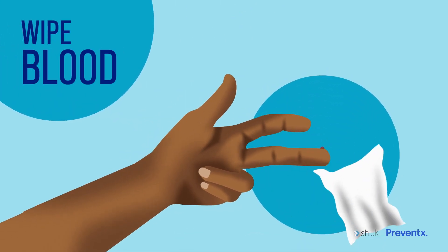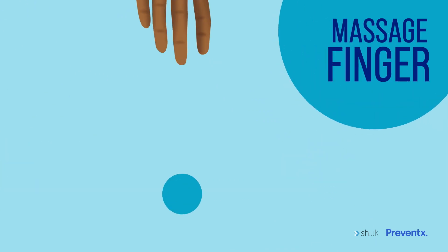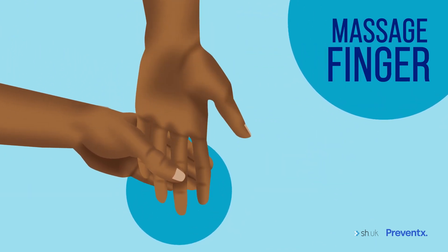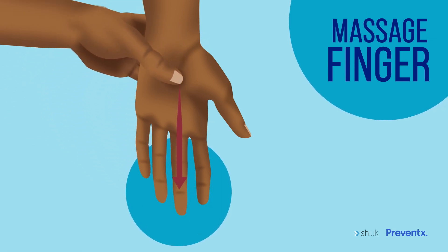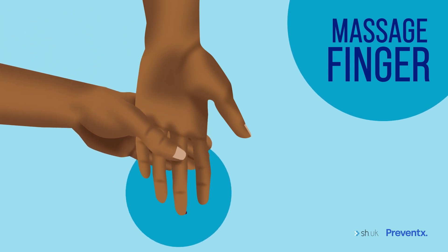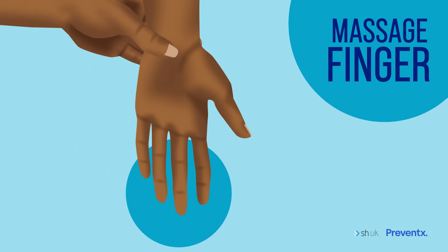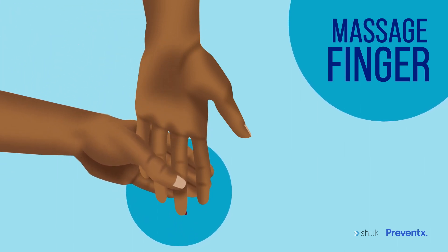Then wipe away the first drop of blood with a clean tissue. A top tip is to stand up if you can and gently massage your finger from the very base to the tip. It can even help if you start at your wrist and massage from there down to your fingertip. Take care not to just squeeze the tip of your finger, as this won't help the blood flow. This bit might be tricky and feel a bit strange, but stay calm and keep trying.